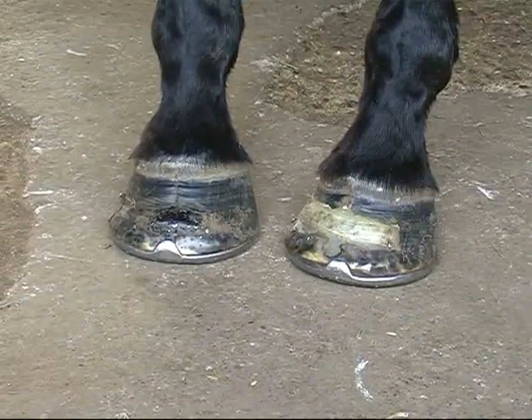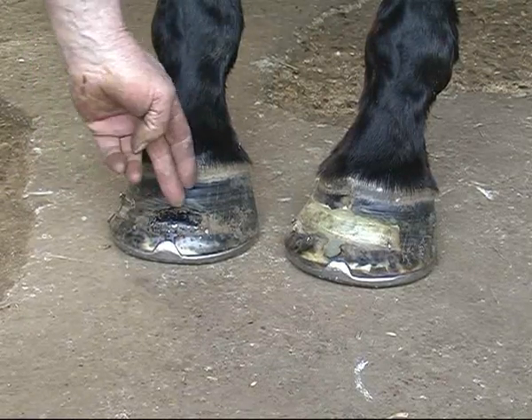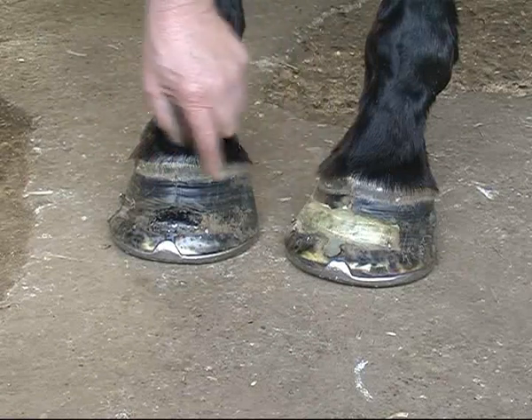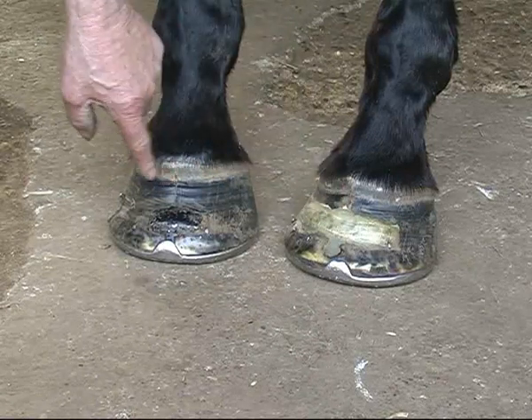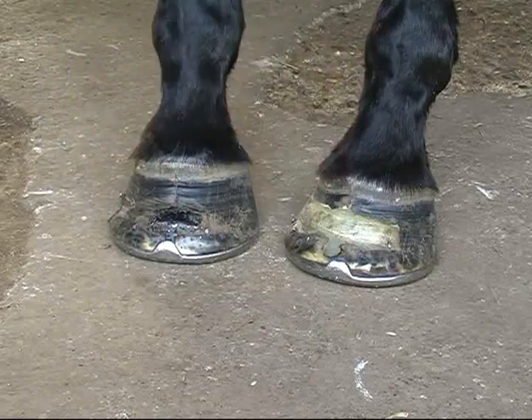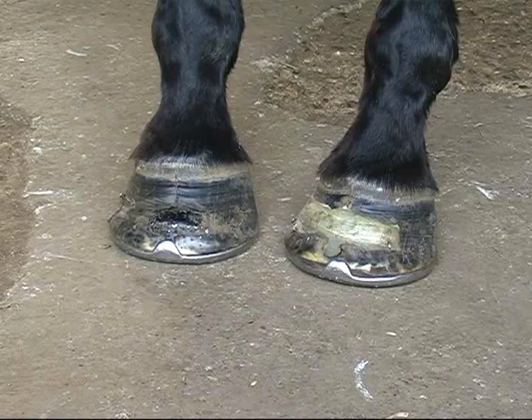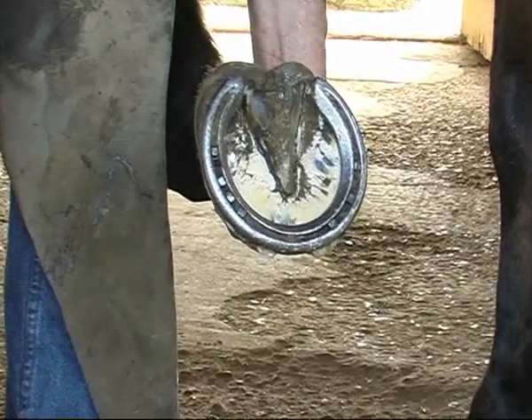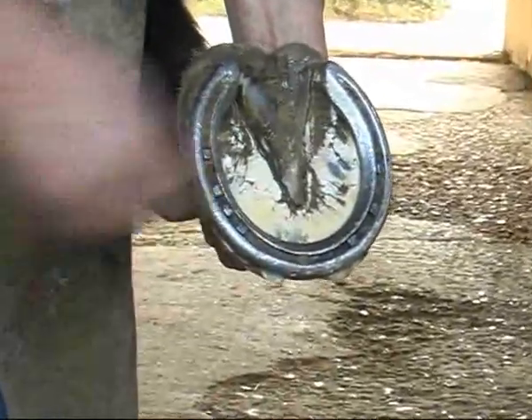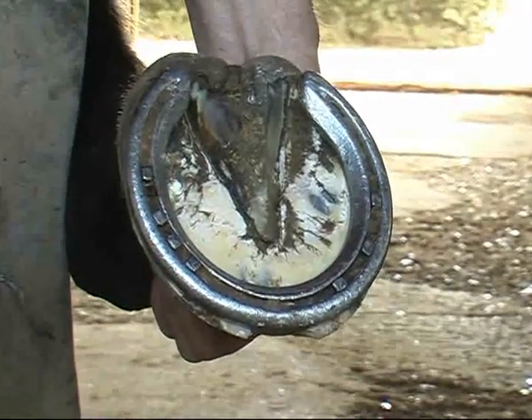First job I'll do is just take the shoes off and nail them back on. I'm going to decide once we've got it off whether to take this off and put a band on, because I think we really need to help this horse now to get to this stage from that stage. I think I'll put a band around here, leave this one as it is, and we'll review it again in another eight weeks when we come to see him. This is the foot that we've banded regularly, changed the bands and moved them up and down as needed, and you can see the shape of the foot is now just a nice traditional round shaped foot.